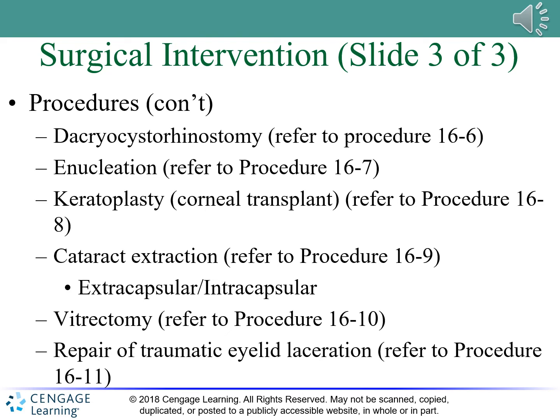Okay. Under the practical considerations, intracapsular cataract extraction involves a large incision and the entire capsule is removed. Suturing is required for closing the incision. Extracapsular cataract extraction is performed through a small incision and only the lens is removed. Incision is self-sealing with no sutures required.